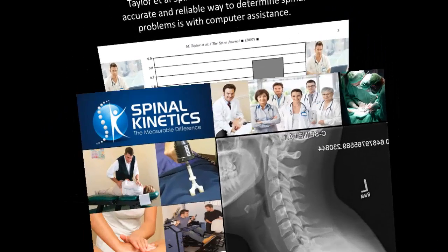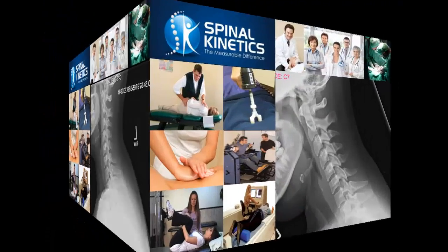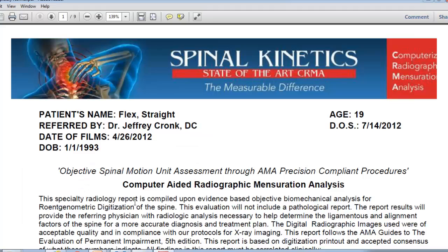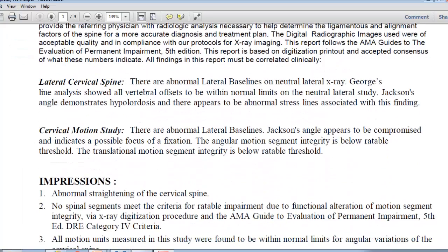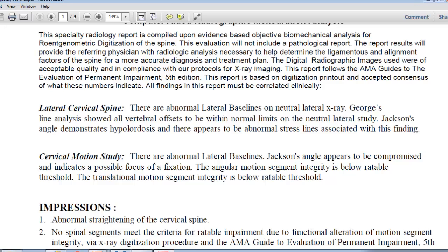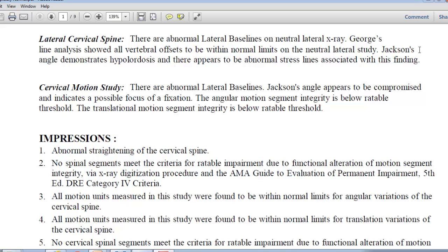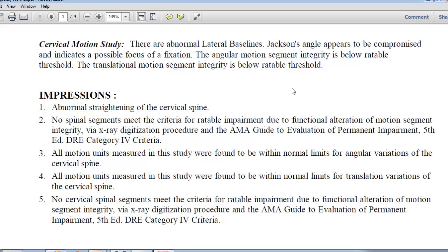Looking at a normal neutral, a flexion, and an extension x-ray, we pull up the report and drop down to the lateral cervical spine. We see there's no break in George's line and everything is below rateable. There's no significant joint laxity. Going into the impressions section, all angular and translation findings are within normal limits — this is a Grade 1 sprain finding on radiograph.